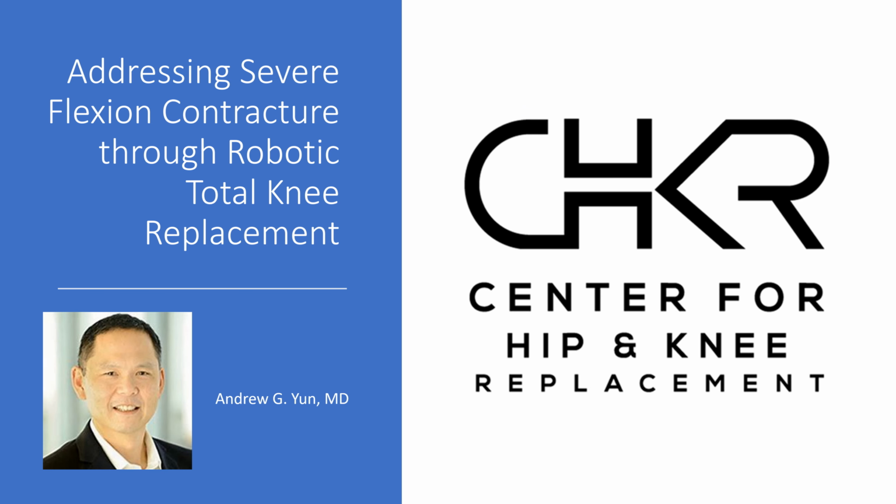So severe flexion contracture is one of the more challenging things to manage in robotic assisted knee replacement, sometimes because you just can't get a starting number. And so you'll have to switch tactics completely to a measured resection technique. The measured resection technique will get you close.